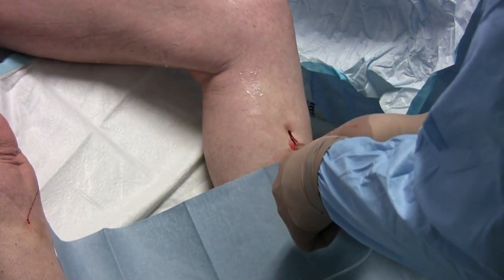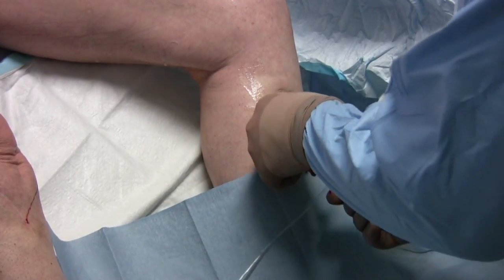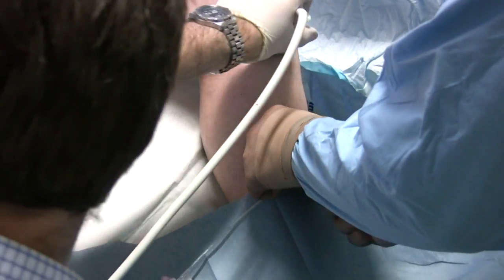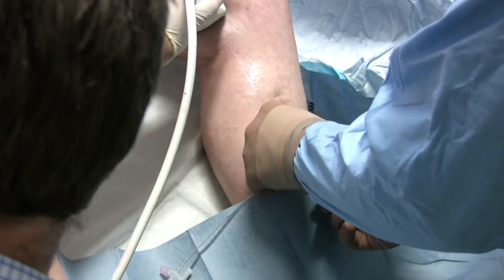Once again, the access sheath slides over the wire guide into the vein to be treated. Confirmation of acquisition of the vessel lumen occurs with ultrasound.